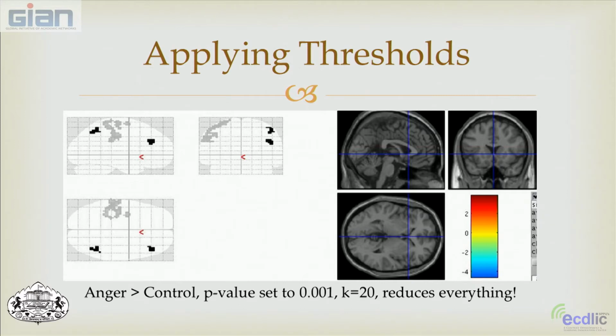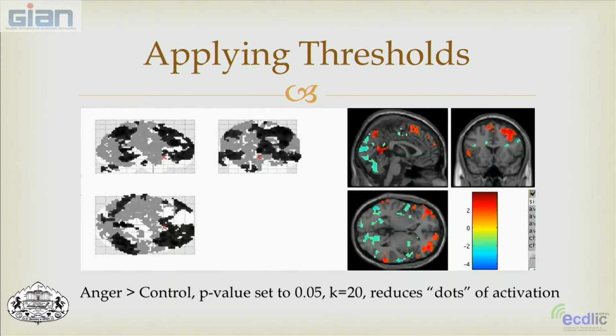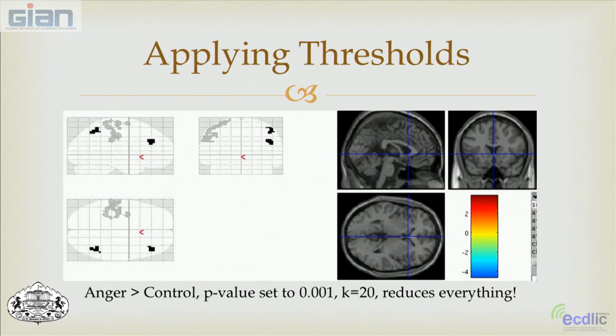And we see on our glass brain here, there were a few spots, but not like before. So if you look at this glass brain before, you can see how much activation we're seeing, both in the positive and negative tail. Here we've wiped out a lot of that. So this is a very conservative threshold for us.